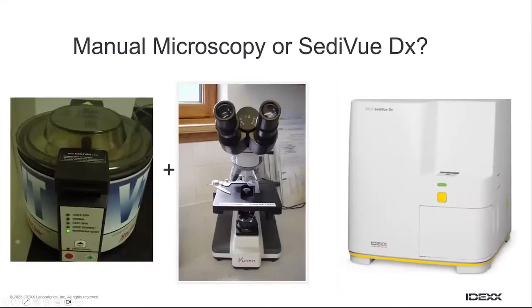So for the sediment examination, how do we perform that? Well, it requires a little bit of equipment, and in most cases, that's going to be a combination of a centrifuge and a microscope, nothing much more than that. You may be aware that the SediVue DX exists, and it kind of takes the place of the centrifuge and the microscope.